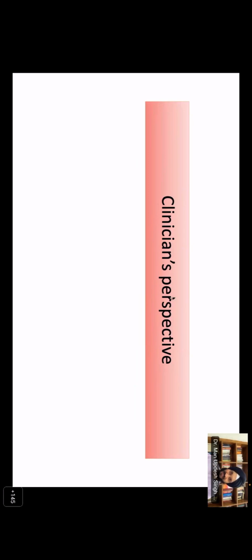So I don't know why it comes in the picture, but usually more than 1 or 2% is considered significant in peripheral blood in most adults. It should be less than 1% generally. So that's where the significance starts. But biology is not like mathematics. You need to have a clinical perspective in each scenario. Cutoffs are just meant for assisting you. They are not meant for blocking your mind in diagnosis, right?